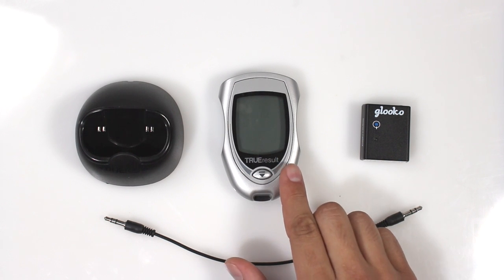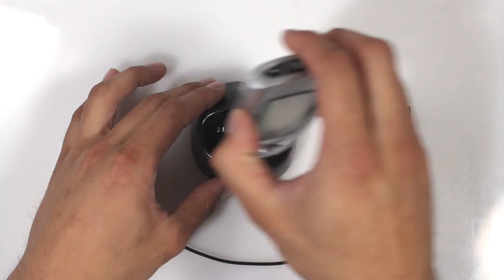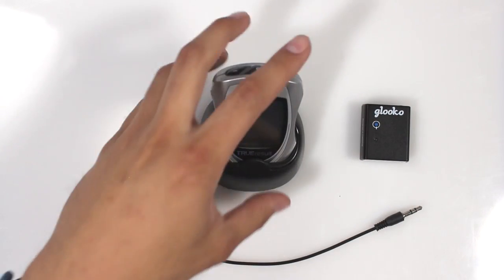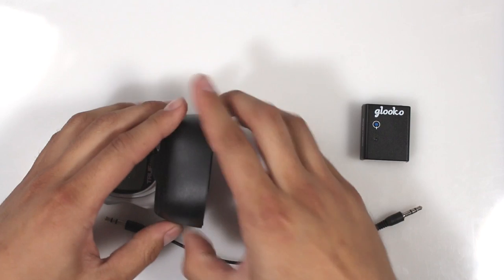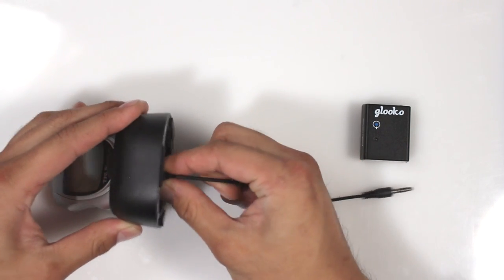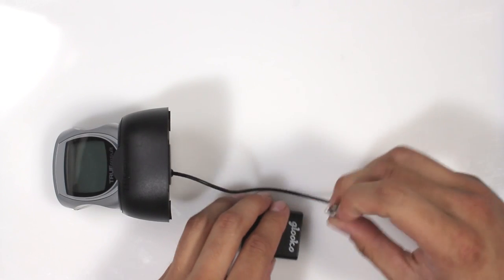Ensure that your TrueResult Meter is off. Place the TrueResult Meter in the TrueResult Dock. The Meter Connector should be placed into the bottom of the TrueResult Dock and the other end of the Meter Connector connected to the Gluco Meter Sync Blue.